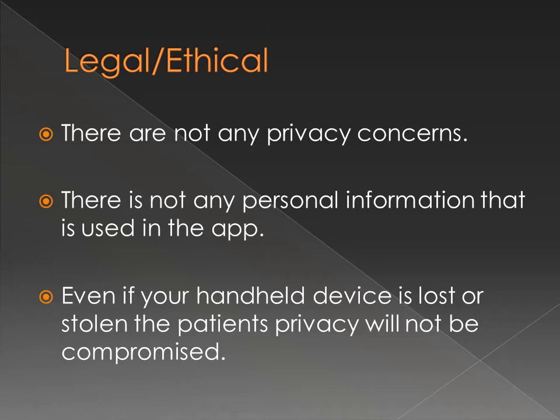Another advantage to this app is that there are not any privacy concerns. There is not any personal information that is used in the app. Even if your handheld device is lost or stolen, the patient's privacy will not be compromised. The only information that the app uses is the age and lab values.